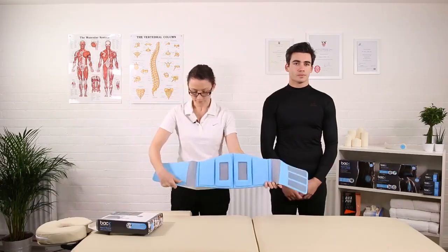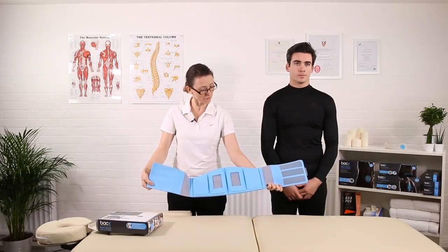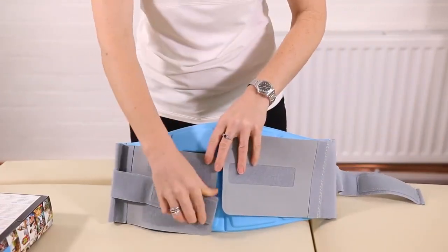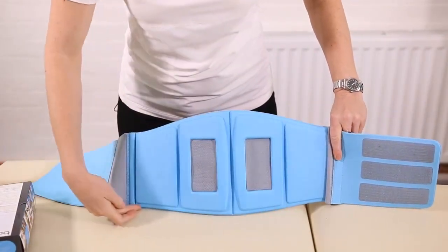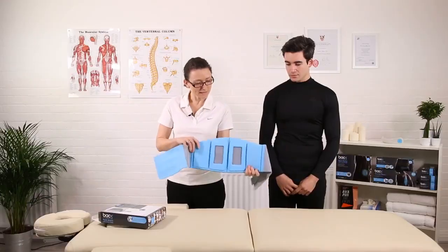Then we have the belt portion of the brace. You'll notice there are two velcro parts to it. Before you put the brace on, it's important to bring these two small straps out of the way. We position the brace on the back with the flat portion towards your bottom.